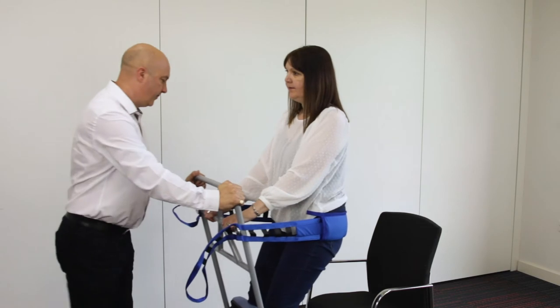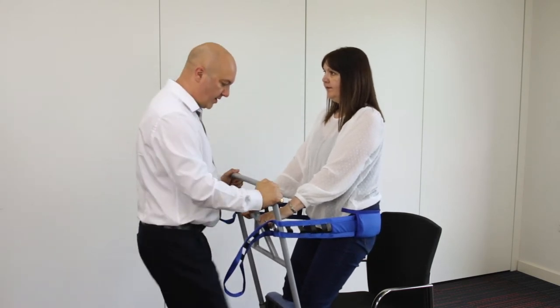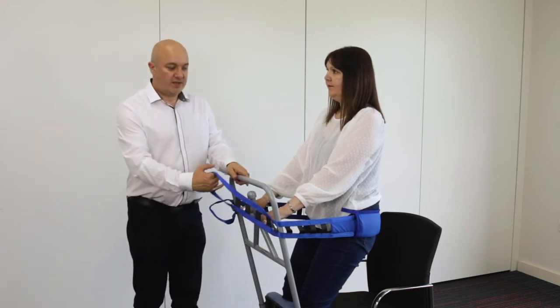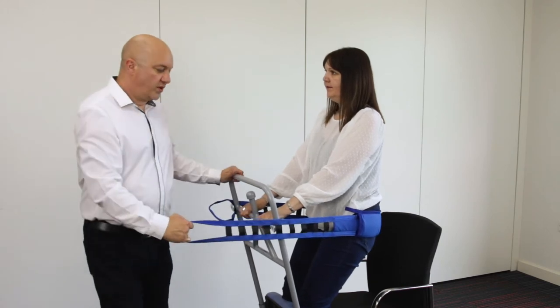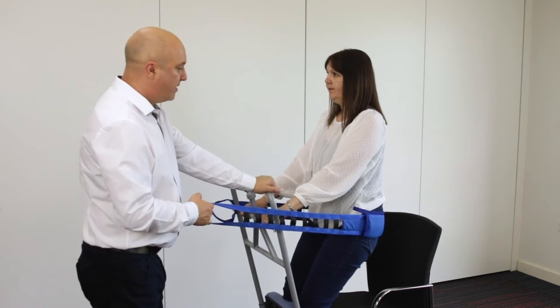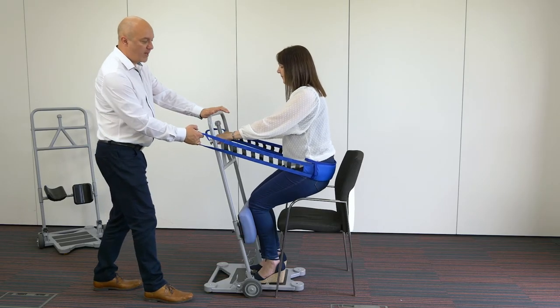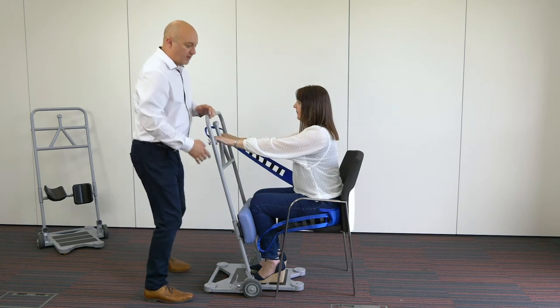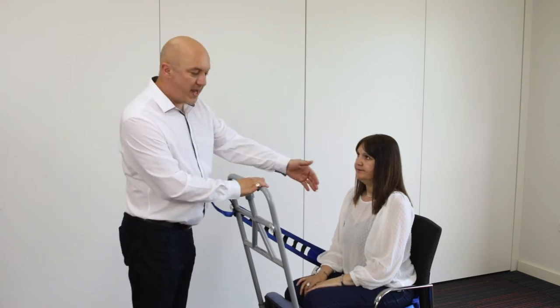In this case we're going to go back to the same chair. Bring Sarah back into position and reactivate the brakes. If Sarah needs support in sitting as well, come at an angle, pull on the handle and walk to the side — it releases the belt from the disc. Hand on there again, and whenever you're ready Sarah, sit down. I can control the pace of sitting until she lands in the chair, so we don't get a flop into the back of the chair in a bad position.